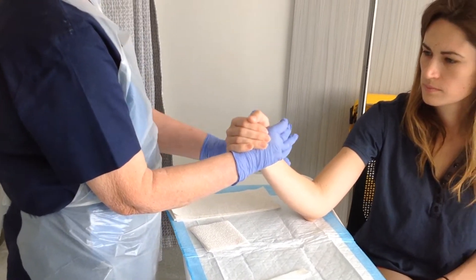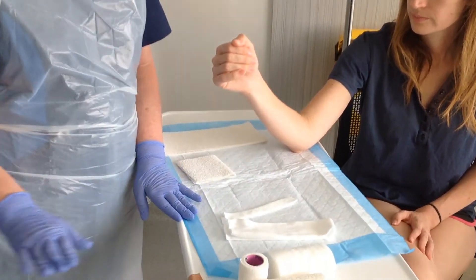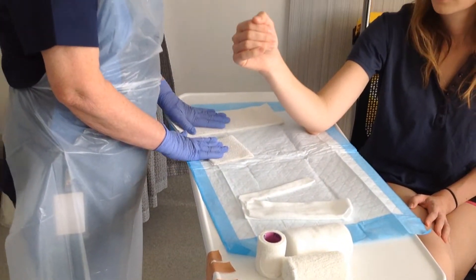Now we've got the thumb in its neutral position and the wrist is in alignment. Slide your thumb out and just leave their hand so. You need to gather your materials next, which is some cool water, bandages, some soft band, stockingette, and your plastering for splinting.